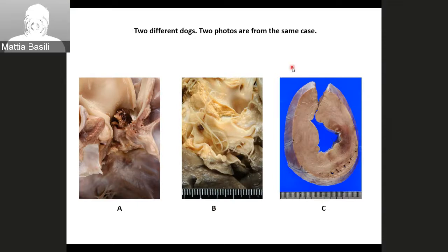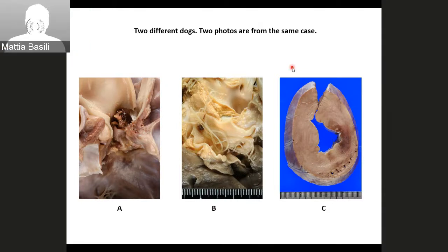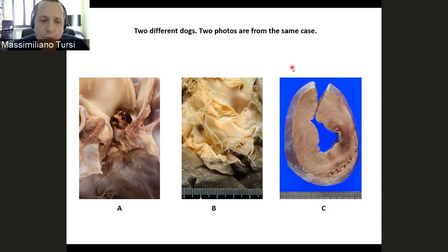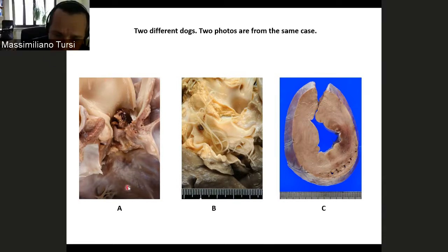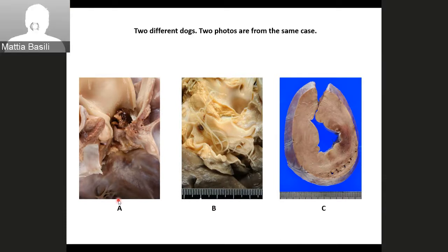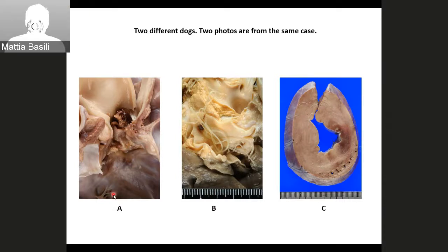That's an outflow tract, of course. That's clear. I look at an artery and I look at a myocardial wall, and something in the middle. I was talking about those trabeculae down there. I thought that was the right ventricle due to that.